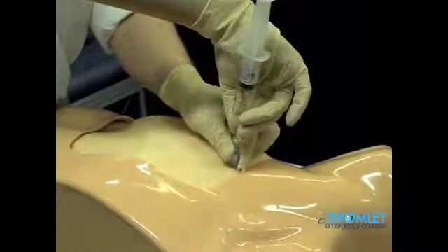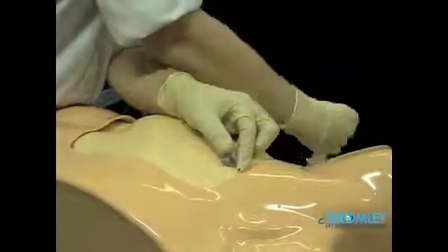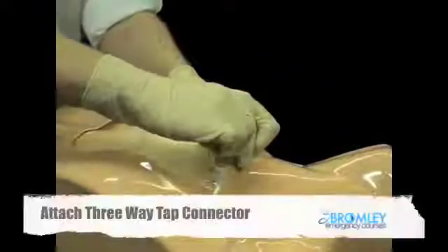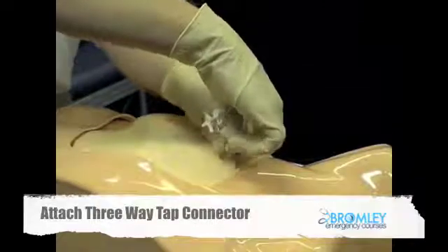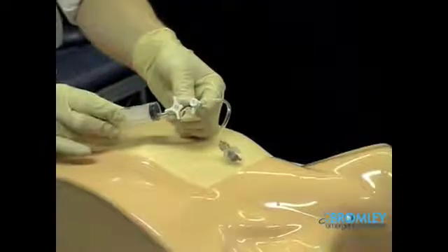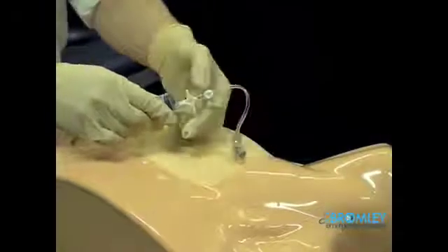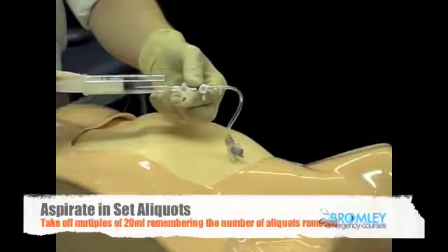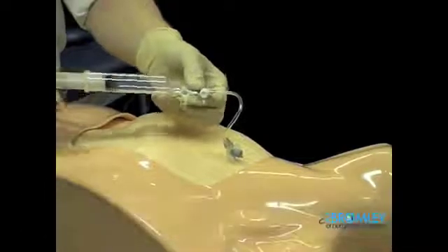Now remove the syringe and needle from the cannula, ensuring that the cannula is anchored securely. Then attach a three-way tap. By placing a three-way tap on the end of the cannula, a syringe can now be used to aspirate aliquots of air and allow you to then discard the air without having the fuss of taking the syringe off every time.